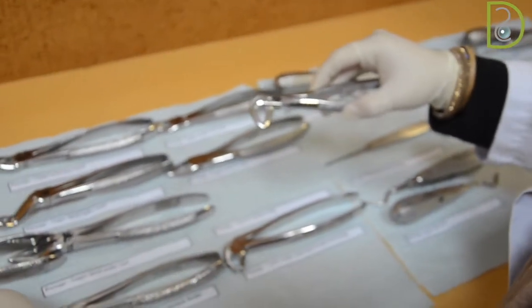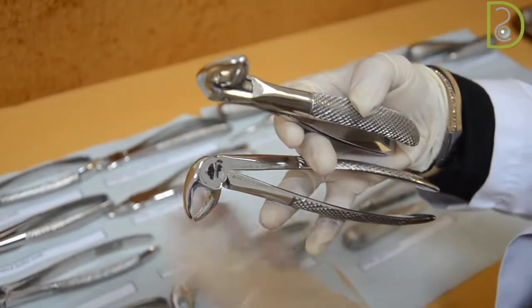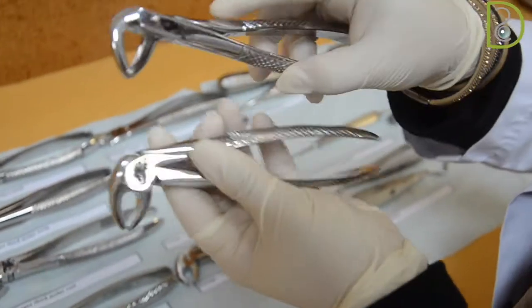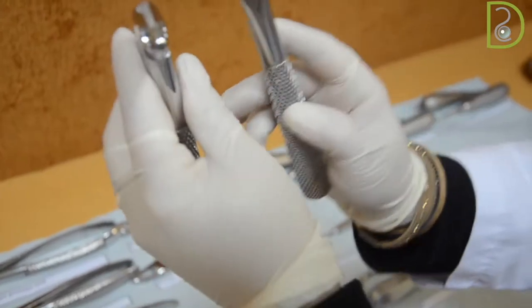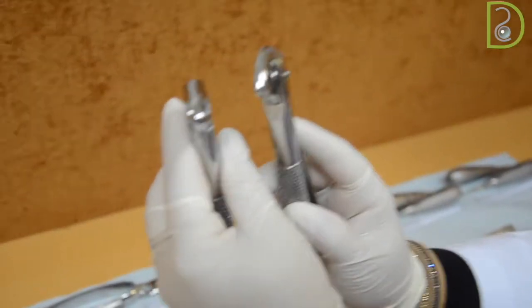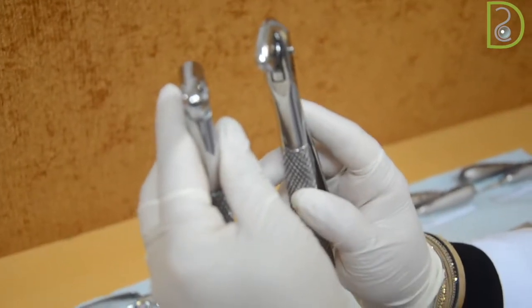Now, there is something to distinguish between the lower premolar and the lower anterior forceps. Looking at that, you will find that the beaks of the lower premolar are open, since buccolingually they are broader.